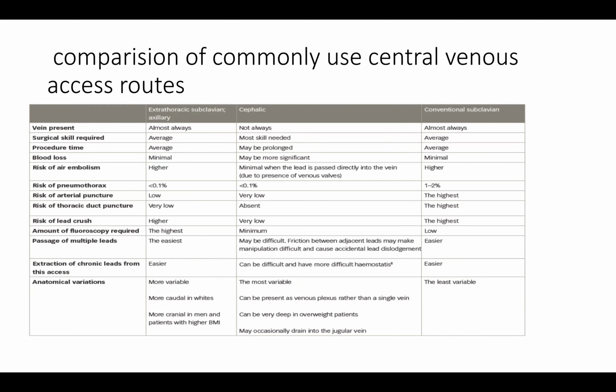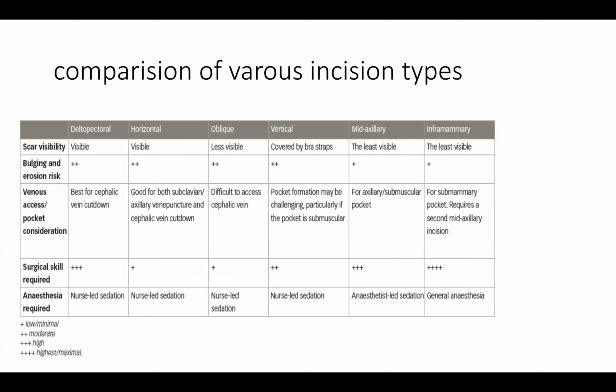And if by mistake, as AJ pointed out, you make a mistake and put a sheath in, please don't take that sheath out. You have to get help, because there are a lot of bones around here. You cannot hold pressure. Don't take that sheath out. Wait for help, and the surgeons have to be available before you take that sheath out.